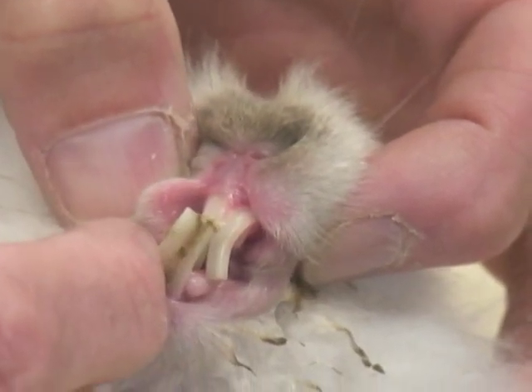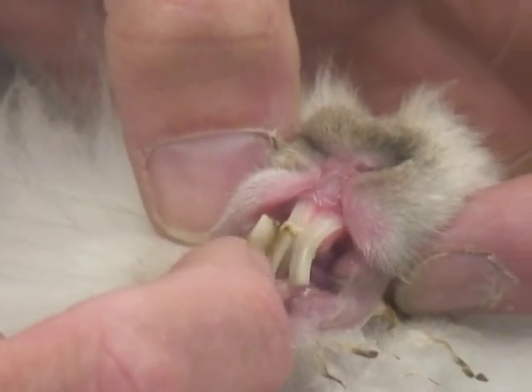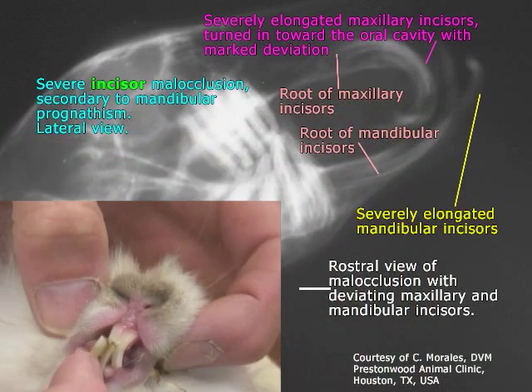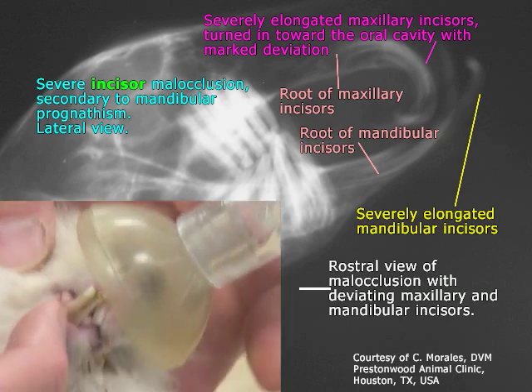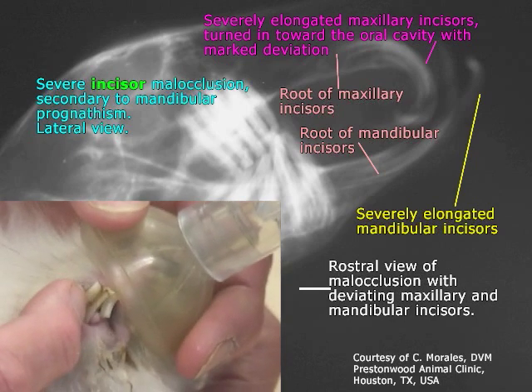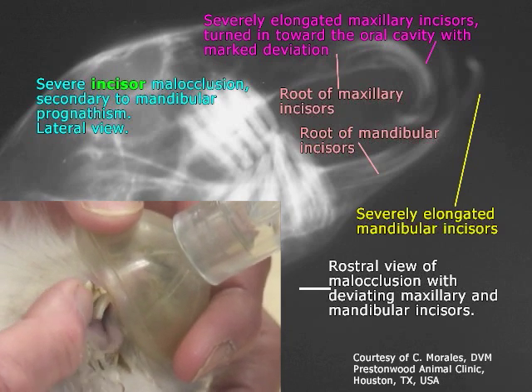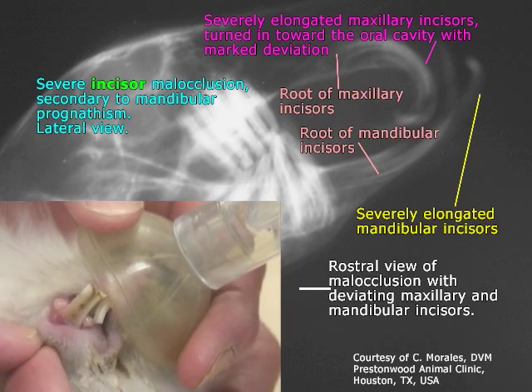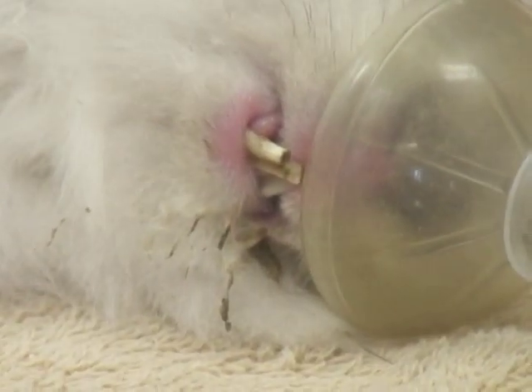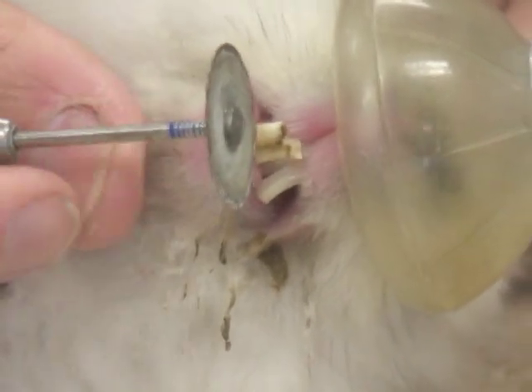These are the lower incisors and these are the upper incisors. You can see that they're not meeting at all — the lower incisors are protruding too far forward and the uppers are behind them. As a result, there's no grinding surface occurring, and because rabbits' teeth grow continuously, they get very long. At some point, they just can't even open their mouth wide enough to get food in. These teeth are doing really no function — she can't grind carrots or blocks of wood because they don't meet. We're going to trim those off first. We have a little cutting wheel that we use to do that, and we're going to cut these off pretty short because they're not really functioning in any way.